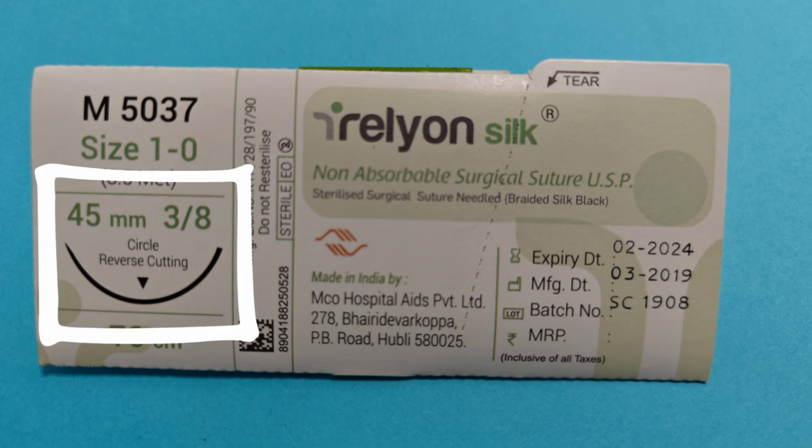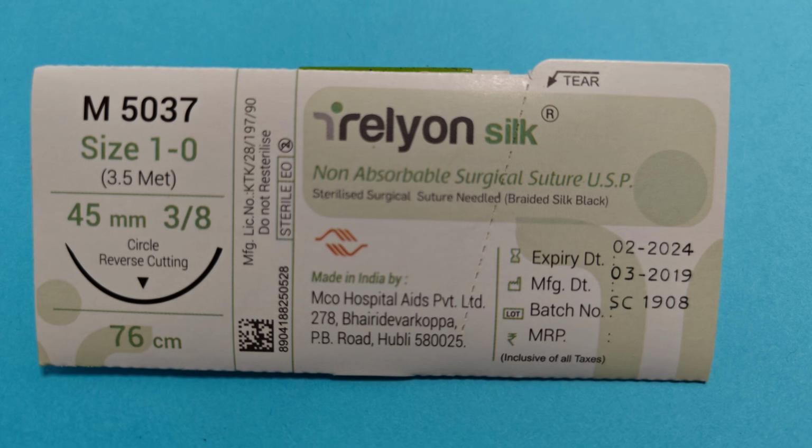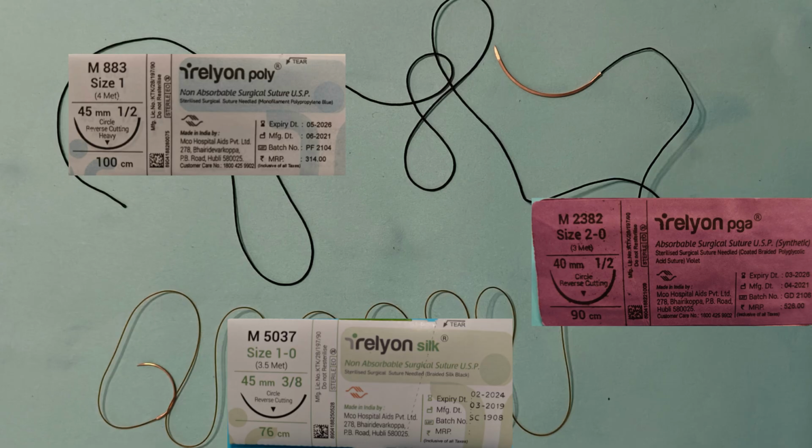Since we are looking at the packaging, let's look at the details of the needle. So this needle is 3/8 curved with a reverse cutting tip. The thread is swaged and the needle size is 45 millimeters. In the next session, we shall discuss sutures.